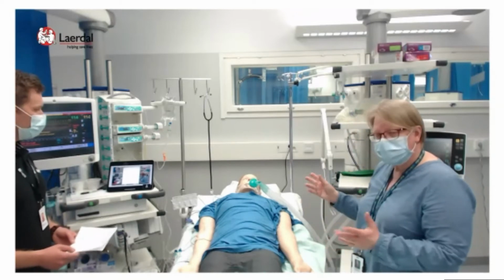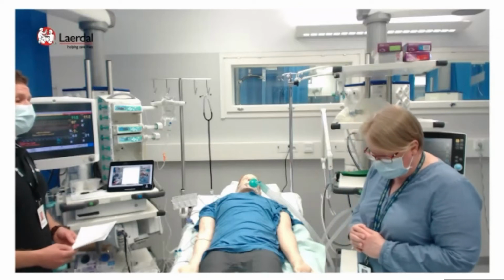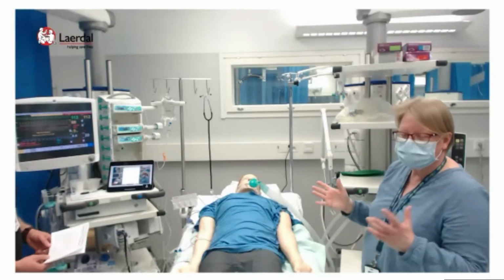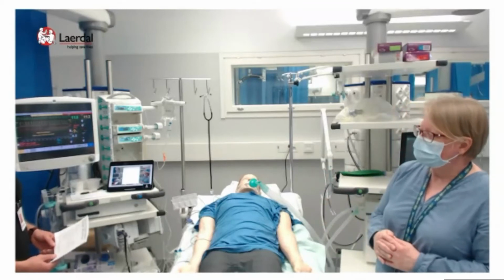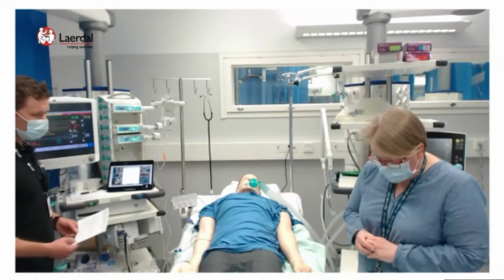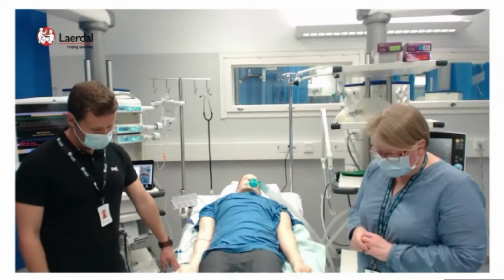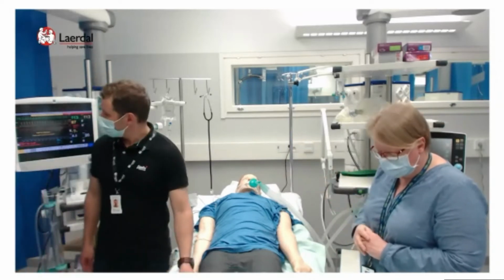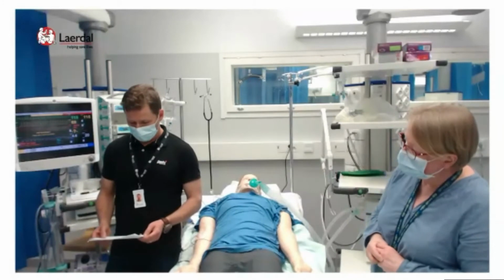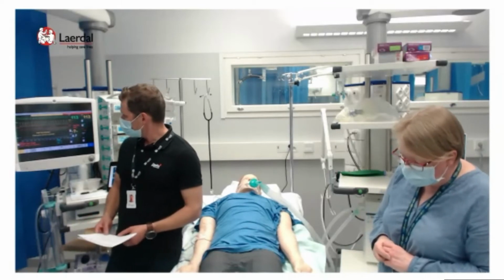In the beginning, the patient is stable. He's intubated. The tube depth is 23 centimeters. The oxygen saturation is about 88, 89. Not very good, but it is the required minimum. We are very happy with this situation. And the lung compliance is around 30 about, and blood pressure is about 100 over 50, and patient is in the sinus rhythm, and there is a rate of 115 beats per minute.